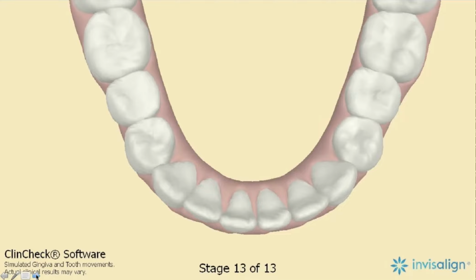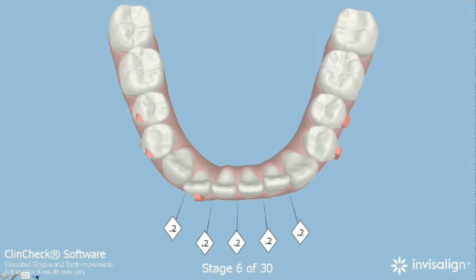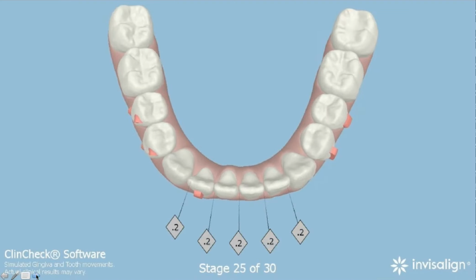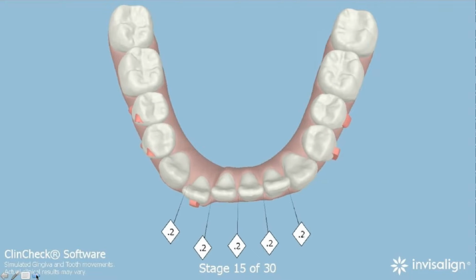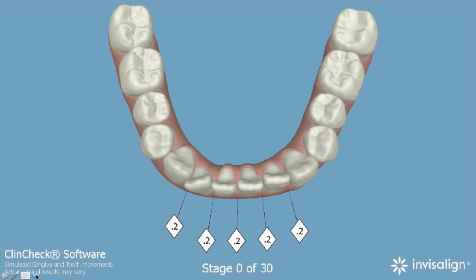The most important point I want to make is that when you go to the crest, when you start that journey back into its final position, you have to have your teeth straight. I will ask you that several times. Are the teeth straight at the crest? Okay, here's an example where the teeth go out, they derotate, and when they turn yellow, they're all straight. Watch that again. When they go out, they rotate around and get straightened out, and they don't turn yellow until they're completely straight.